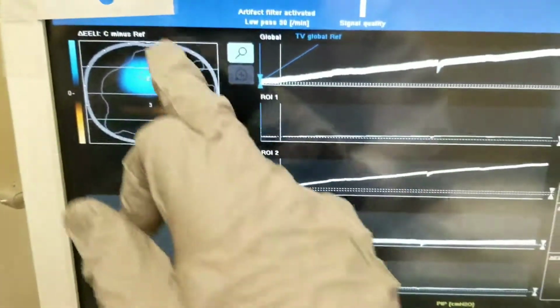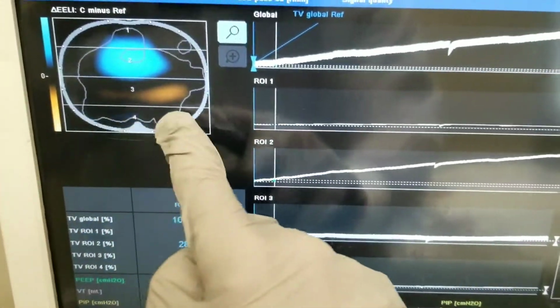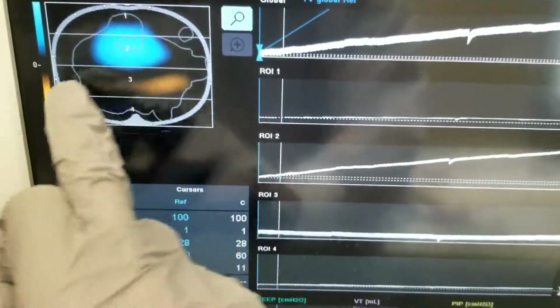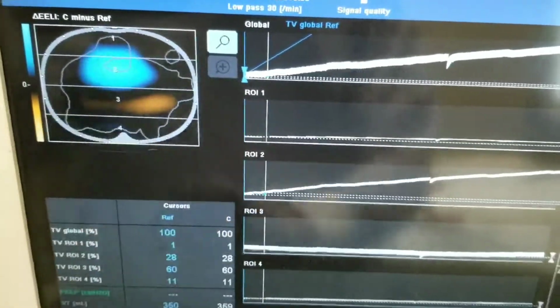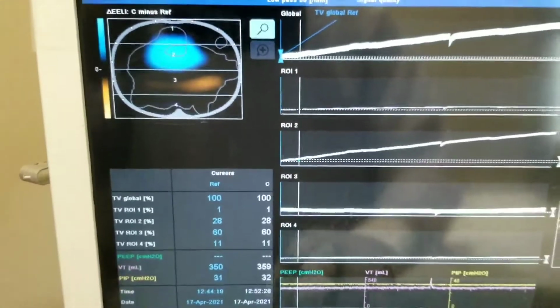Sorry about that. So we're getting blue up here, but you know what? Here it's 11%, and 8 to 15 is normal. So the patient's perfectly recruited here. There's nothing else that can happen but to inflate this deflated area. Okay, I'm going to continue scrolling.